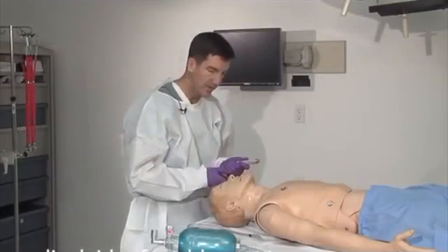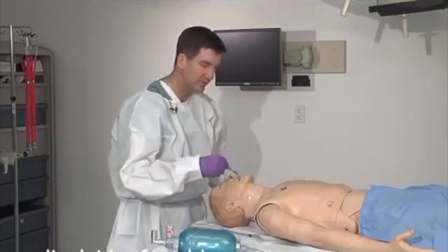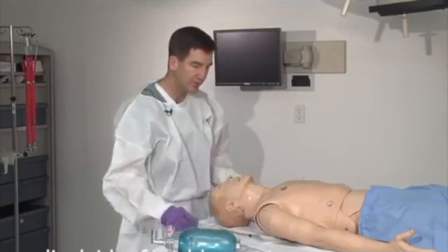We want to make sure we have a tube in the trachea with the cuff inflated — that's the definition of a secure airway. As you prepare, make sure all your equipment is ready to go: the laryngoscope is powered, the bulb is working, the endotracheal tube has the stylet in place with the stylet tip recessed from the end of the tube, the cuff inflated to make sure it's working, and suction is available. With the head slightly tilted, make sure suction is applied so all secretions are out of the way.